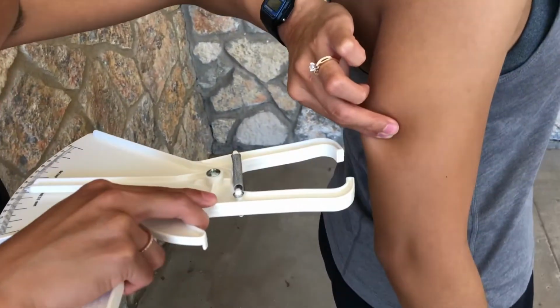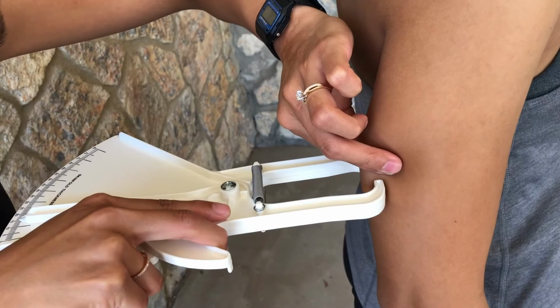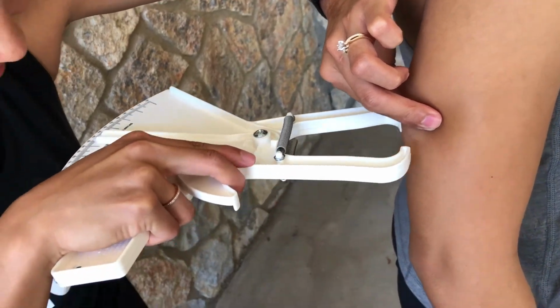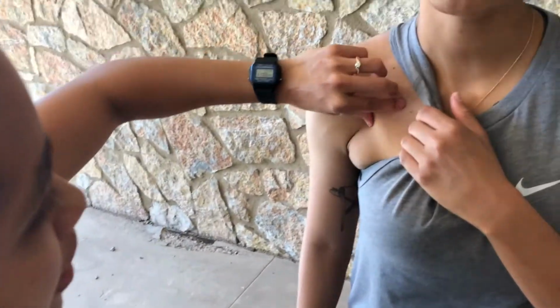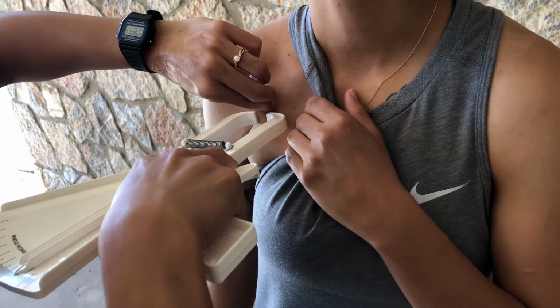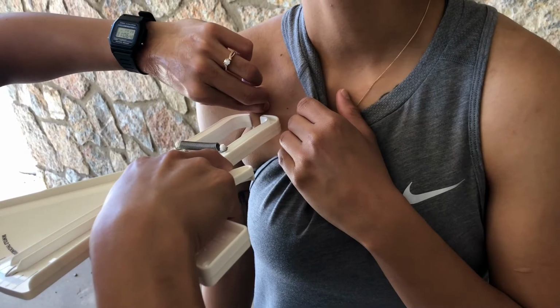The second site is the triceps, and this is a vertical fold on the site with the arm held freely to the side of the body. The third site is the chest and pectoral area of the client's body. This is a diagonal fold, 1/3 of the distance between the anterior axillary line and the nipple for women.